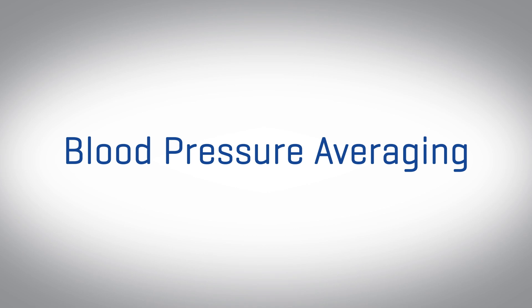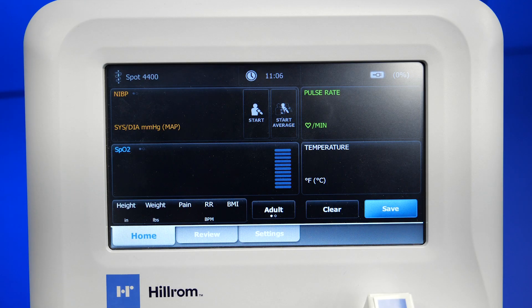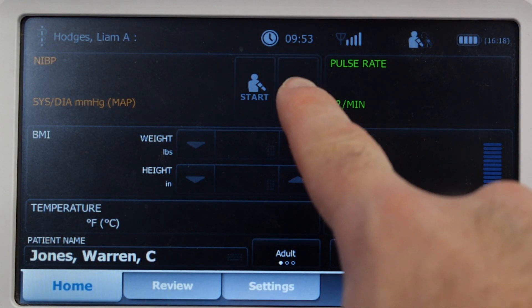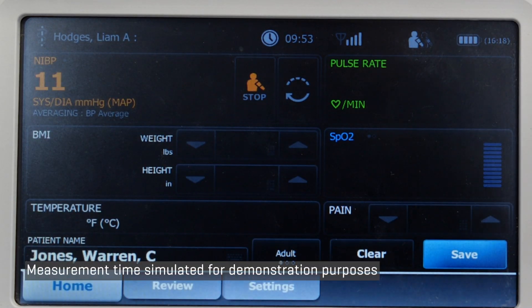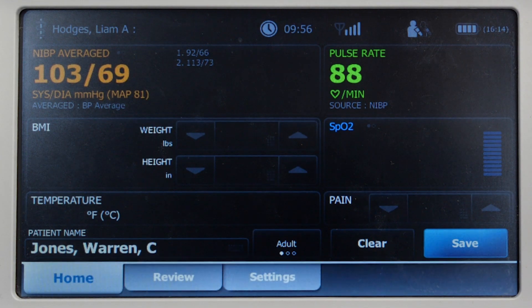To take an averaged blood pressure, a clock icon will appear in the office profile of our Connex devices or directly on the home screen of the SPOT 4400. With the Connex family of devices, tap on the clock and then select one of the protocols that have been programmed. The device will run the protocol as described, and at the end, the averaged blood pressure will appear alongside each individual reading.